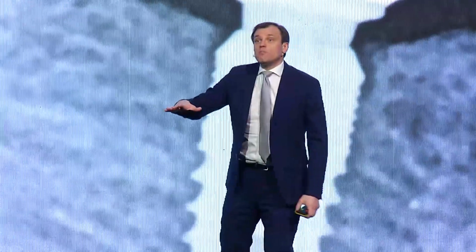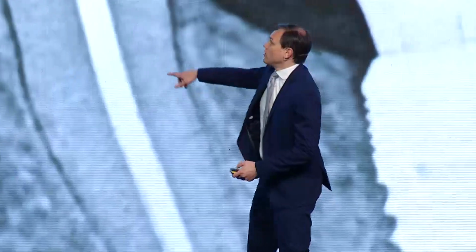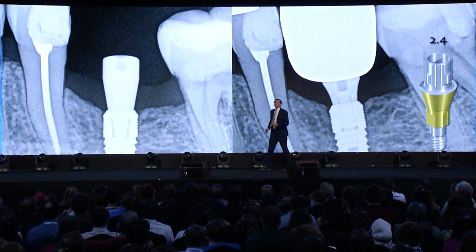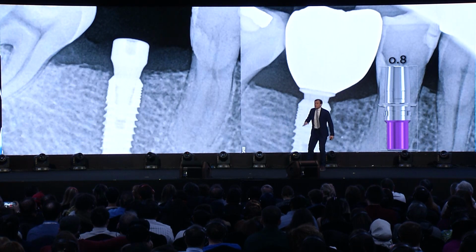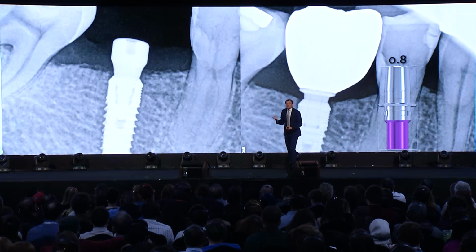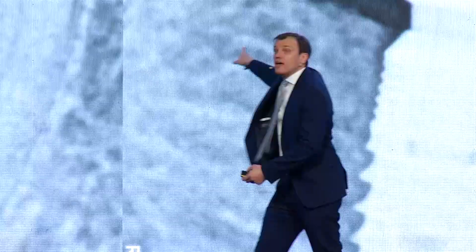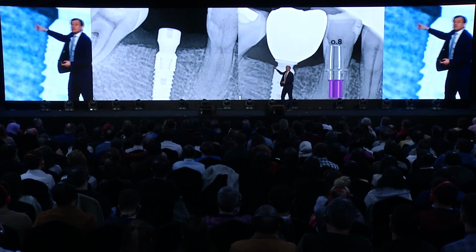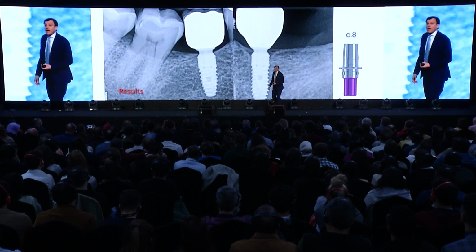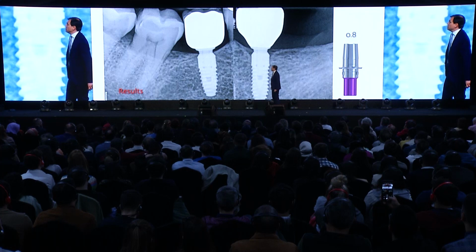At that time, part of the implants received this 2.4 millimeter higher tie base, and another part of the implants received a lower tie base. So this is called a clean study, when you do everything the same except that half of the implants had a low tie base and the other half had a high tie base.